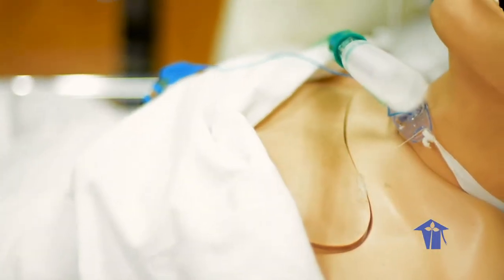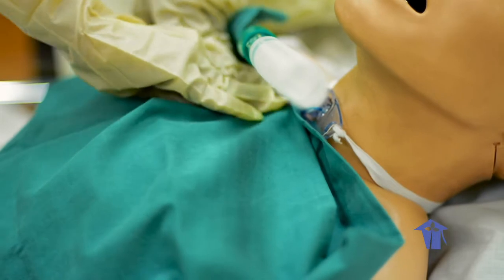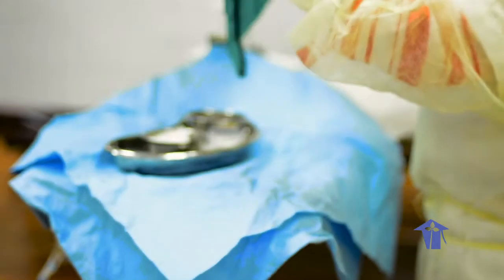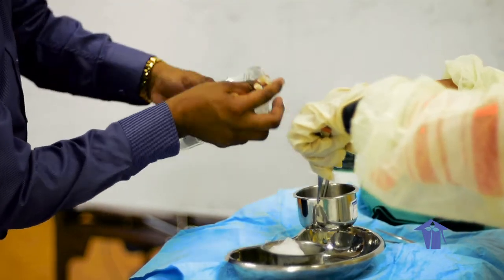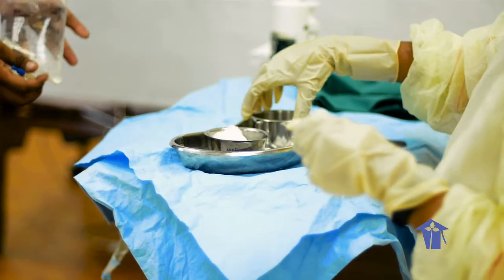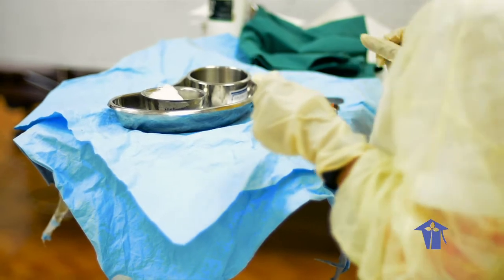You would drape your patient. You would pour your normal saline. Before we pour our normal saline, we would have obviously checked our bag, making sure it is normal saline, checking the expiry date, and that there are no sediments in the bag. So now our sterile field has been set.